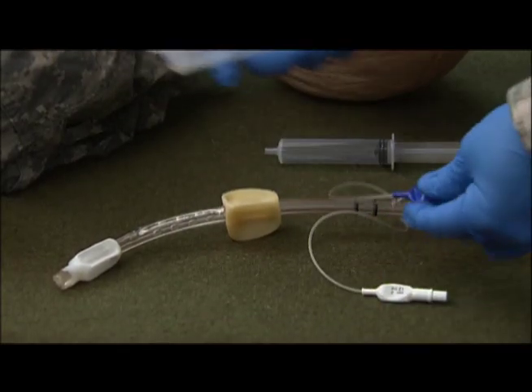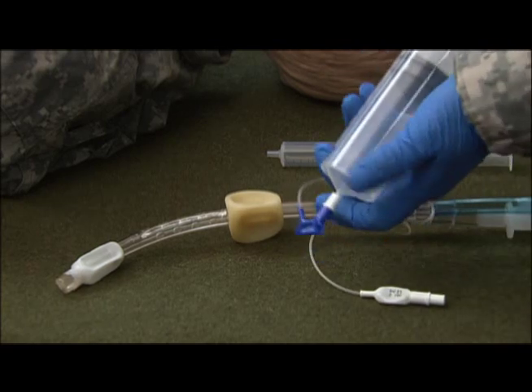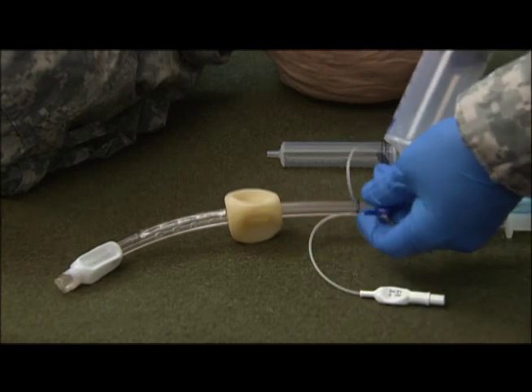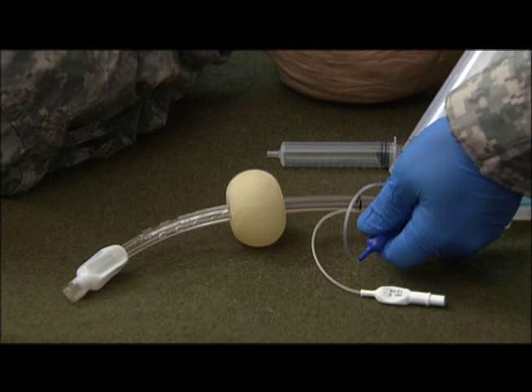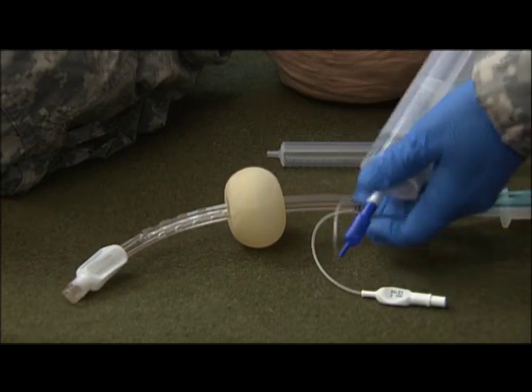We're going to go ahead and take our large syringe and the blue connector. We're going to insert 85 cc's of air into this large balloon. Disconnect and test, and there's no leaks.